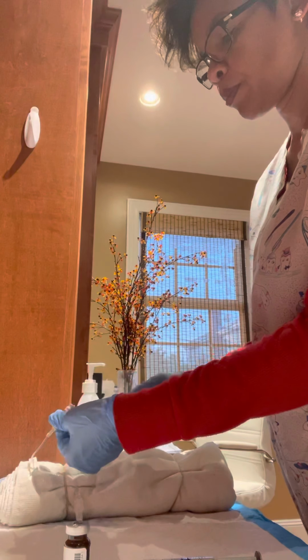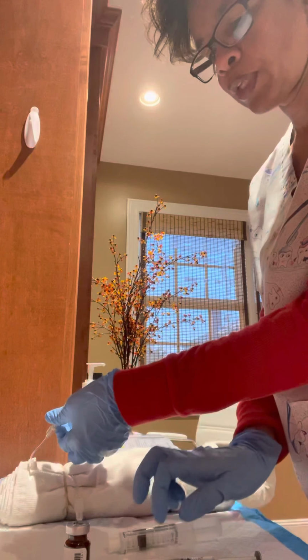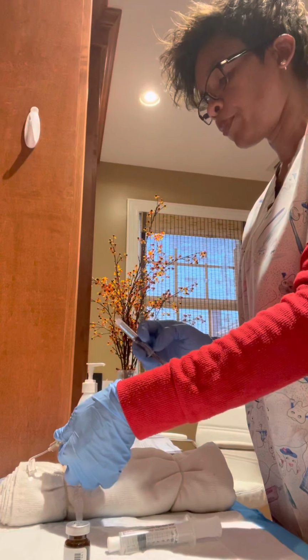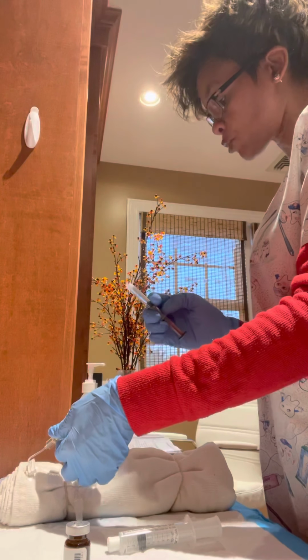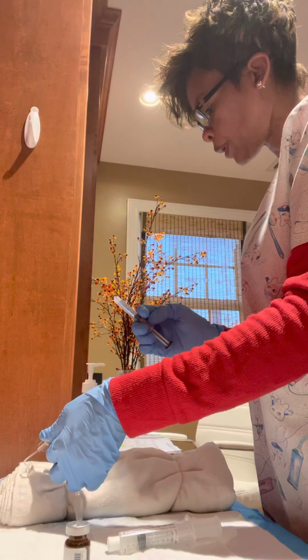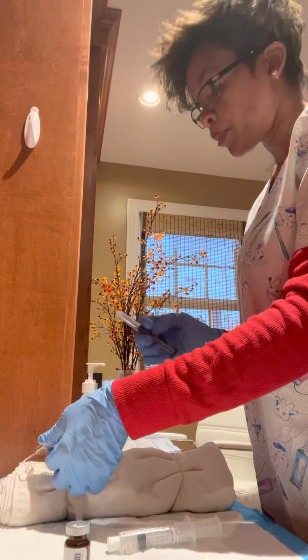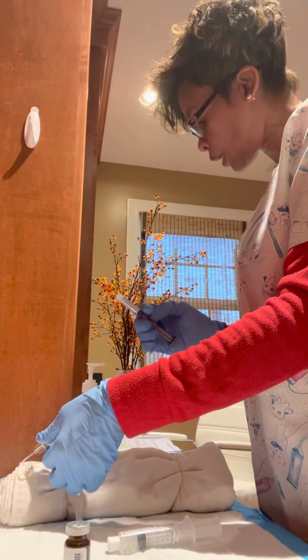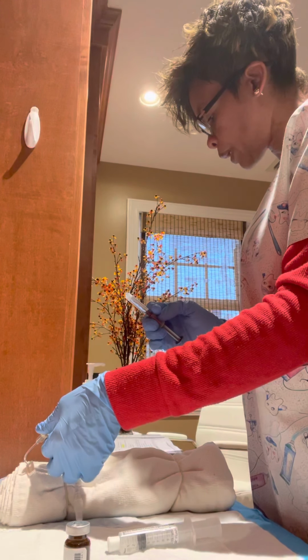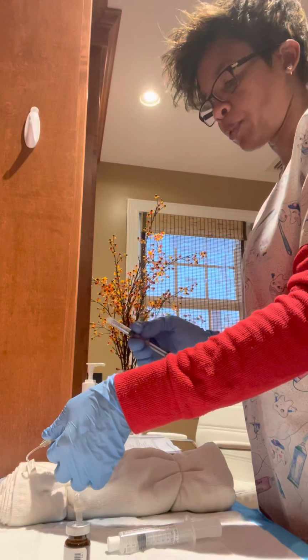Okay, so it's patent, and then I'm just going to cap the saline, leave it here, and then I'm going to infuse the bumetanide, and I have the order right next to me. I've done my checks, but just before I infuse it, again, just verify that I'm giving bumetanide to Mary Edwards with a date of birth of 2/2/40 for fluid overload diagnosis and allergy to penicillin, and it's to be now, and it's an IV push.